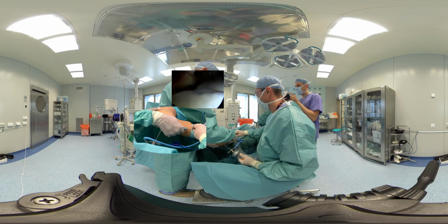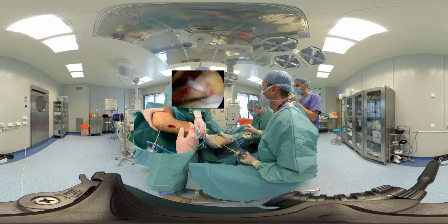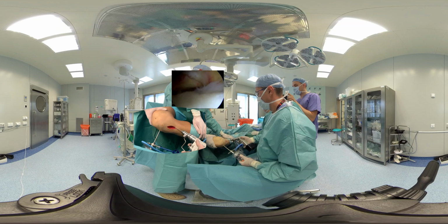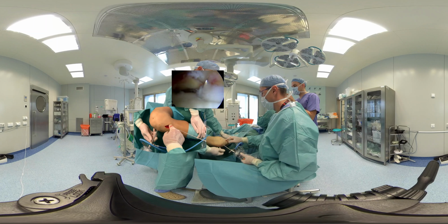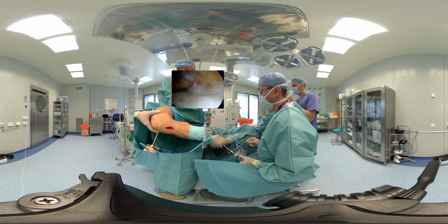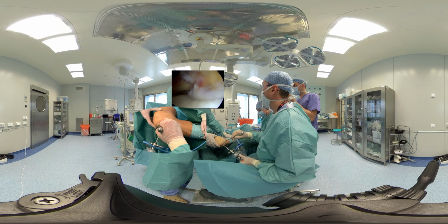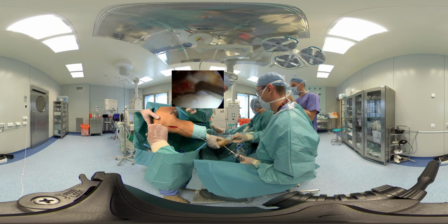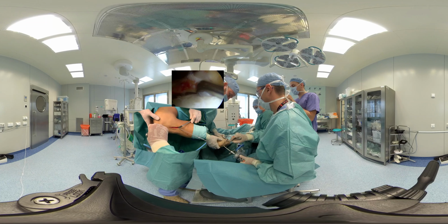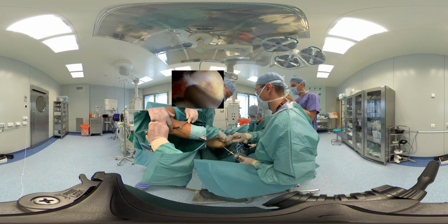After drilling, we remove the offset and place a bone spoon on the end of the wire, which we can see in arthroscopy. We need to do this to make sure not to damage the structures in the knee joint by drilling, especially so that the wire cannot move to the popliteal fossa, damaging important vascular nerve structures.